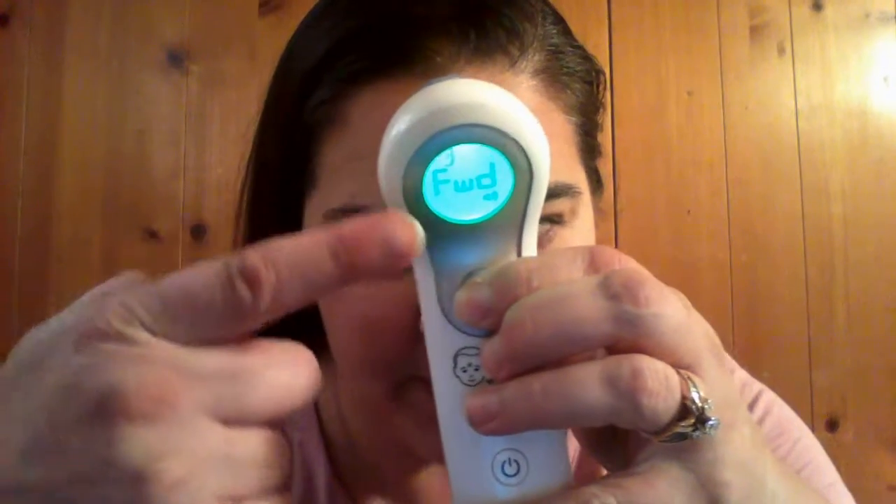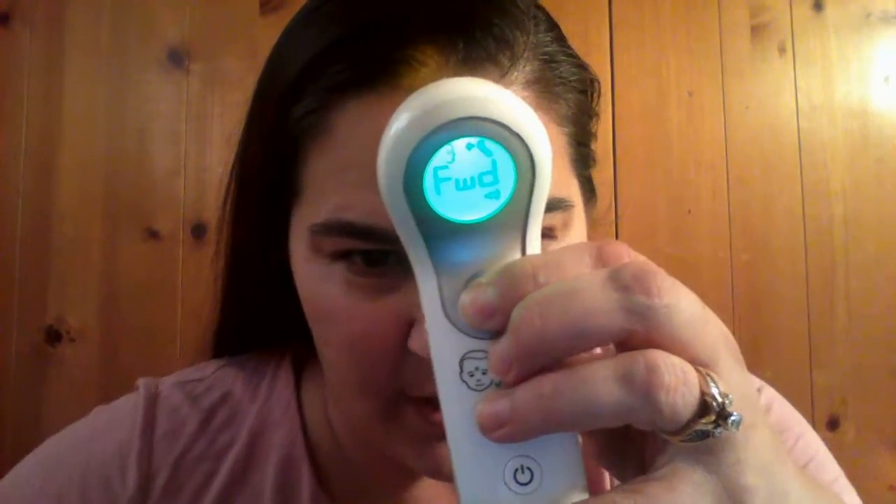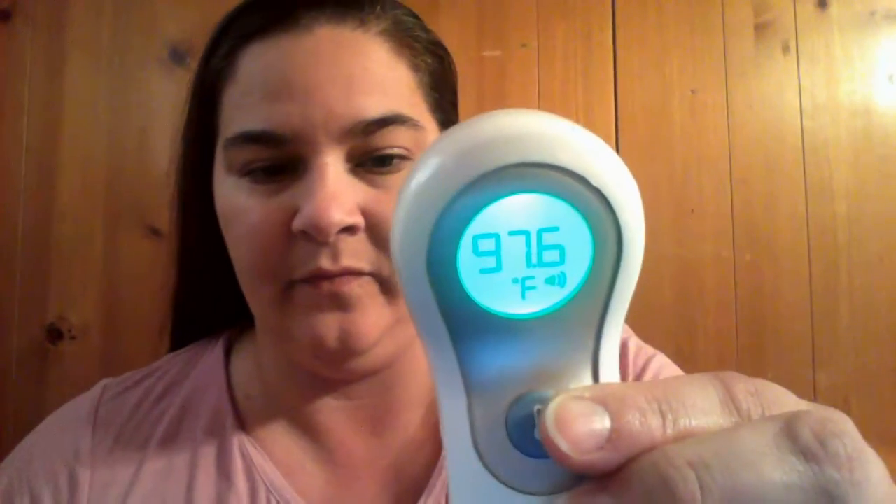I'm doing this on purpose — I'm not at the correct angle, so it's telling me I need to move it forward. I'm moving forward and then there's my reading. It took like three seconds to get a reading, and that's one of the best things about it — it's fast.